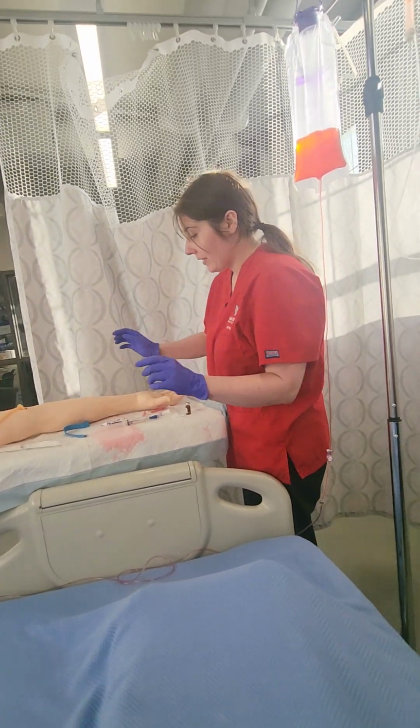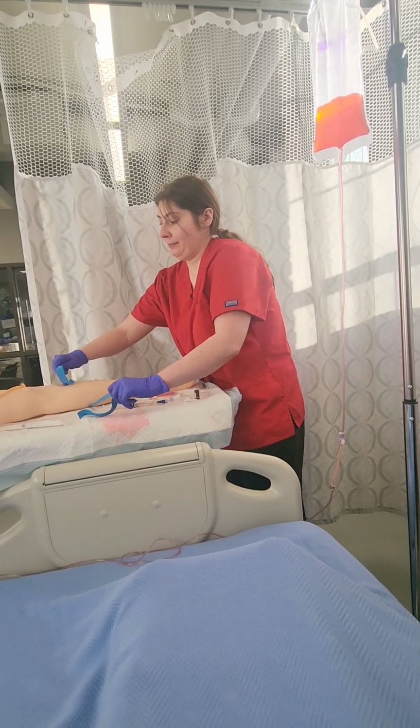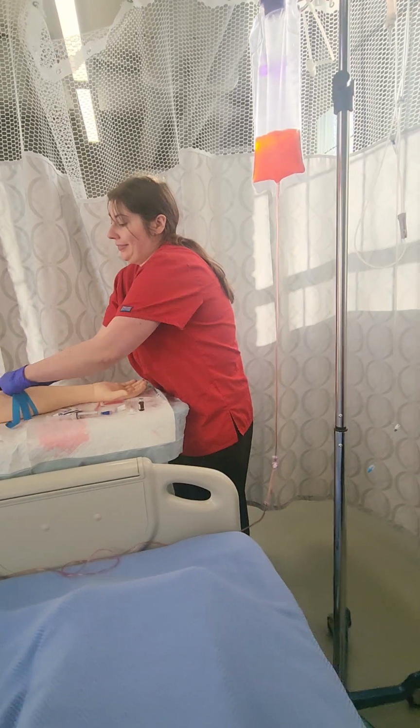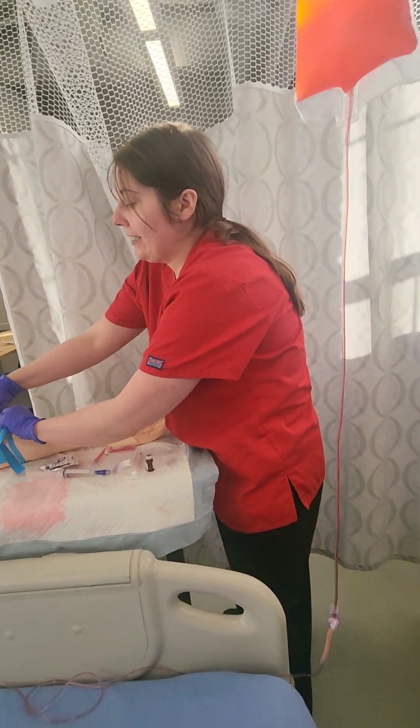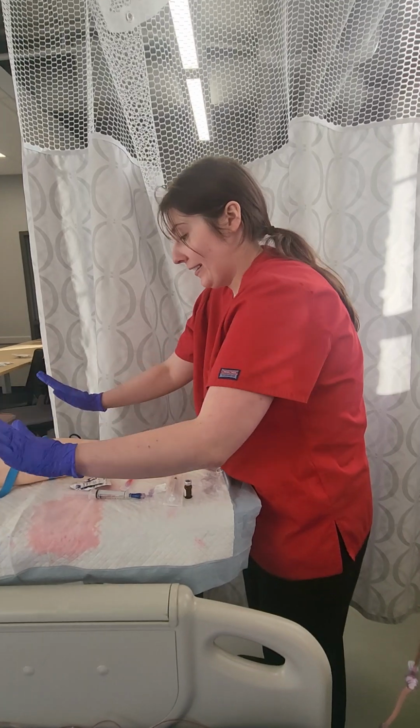Okay, now we're gonna get going. As tight as I possibly can here.